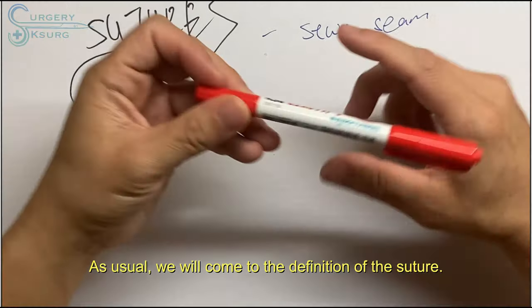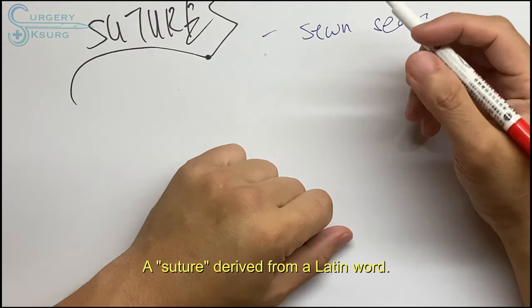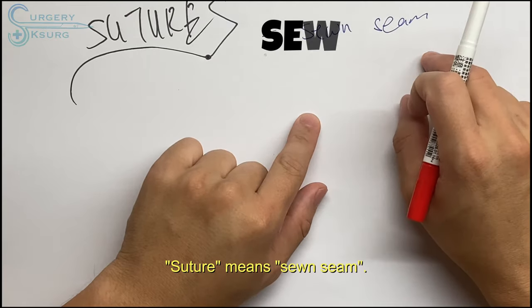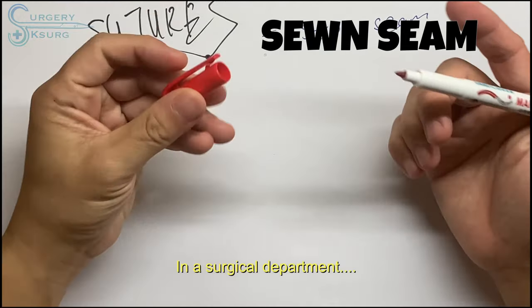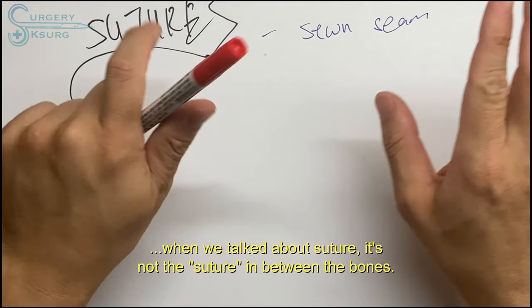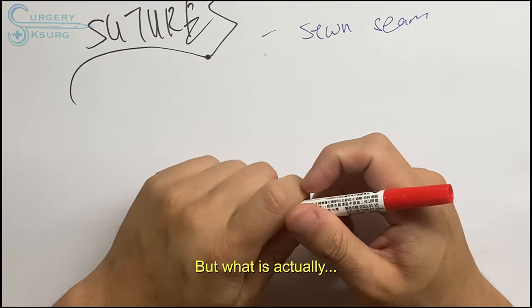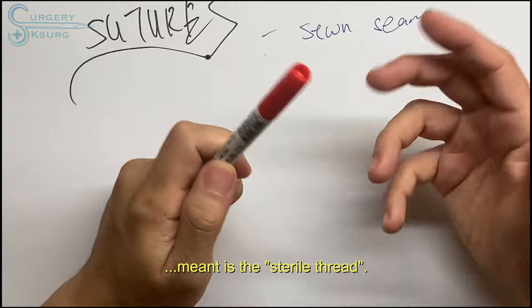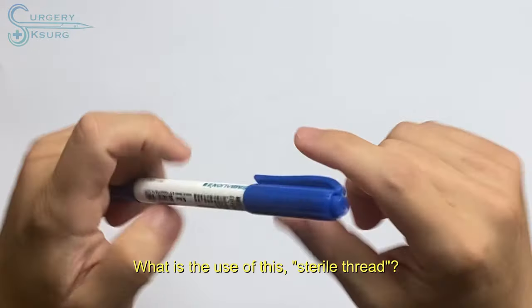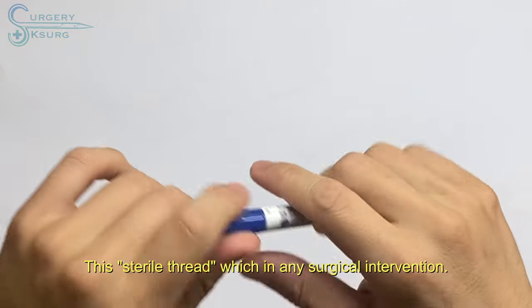So as usual, we will come to the definition of what is a suture. A suture is from the Latin word. Suture means sewn seam. In a surgical department, when we talk about suture, it's not the suture in between the bones, alright? Okay, pun unintended. It's actually the sterile thread. So what is the use of this sterile thread in any surgical intervention?